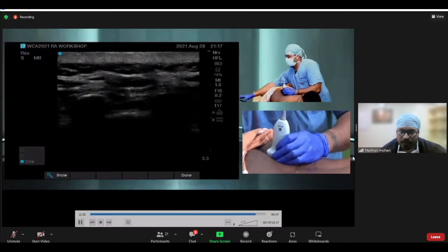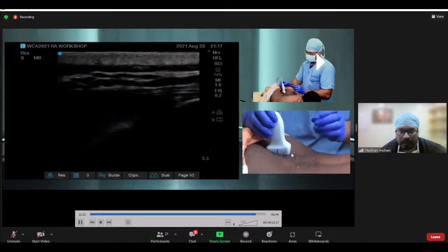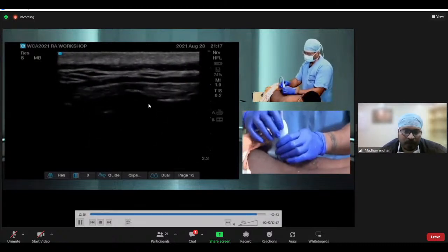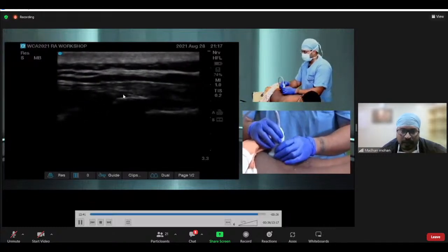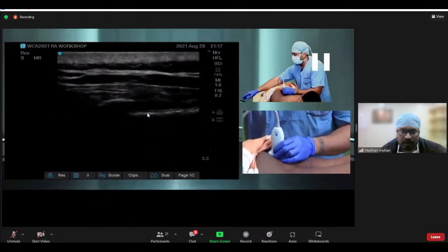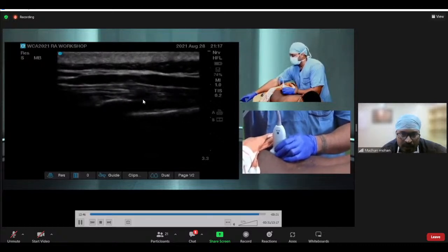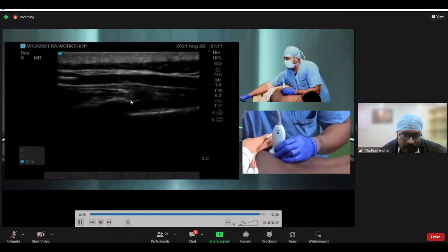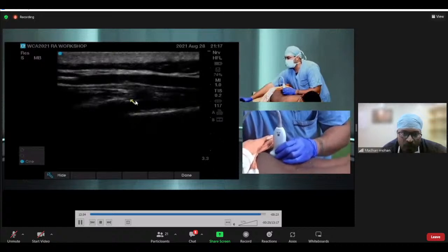The other view which I mentioned is the longitudinal view, where we keep the probe longitudinally at the level of the gluteal cleft. Here the orientation marker is cranial. Once you keep the probe, if it is in midline, you encounter the S4 midline crest, okay? And you see the posterior part of the S5 vertebral body, okay? And in between them, you see the sacral hiatus. So this is the sacral hiatus. And you can refine your scanning and identify the sacro-coccygeal ligament. You see a small hyperechoic line running here. This is the sacro-coccygeal ligament.